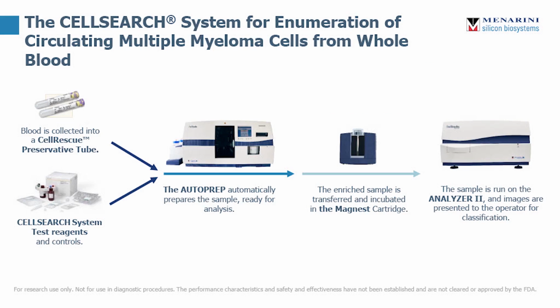So built on the CellSearch platform, we developed an assay to count circulating multiple myeloma cells from whole blood. The blood is collected in the Cell Rescue Preservative tube, which I'll talk about on the next slide.